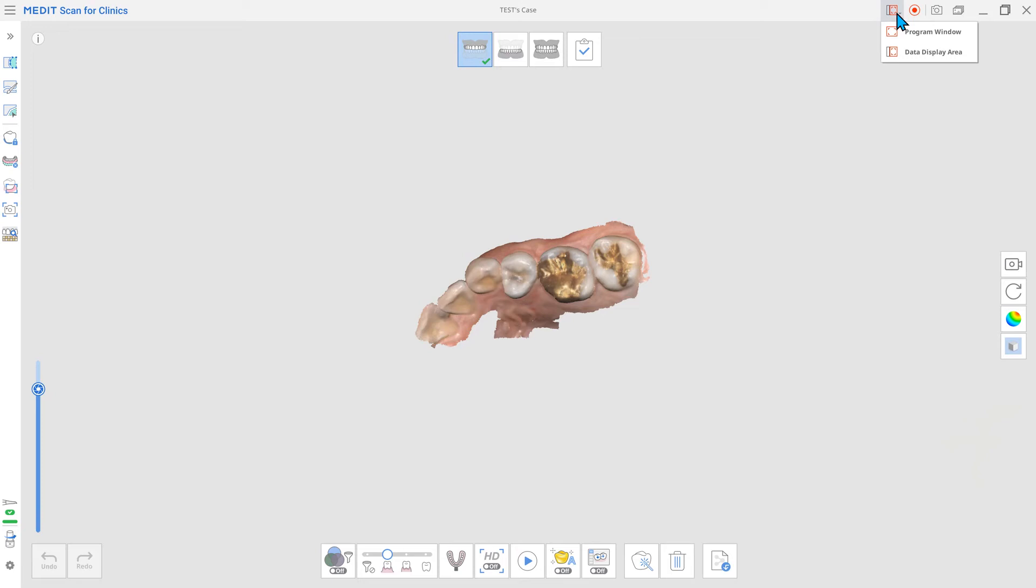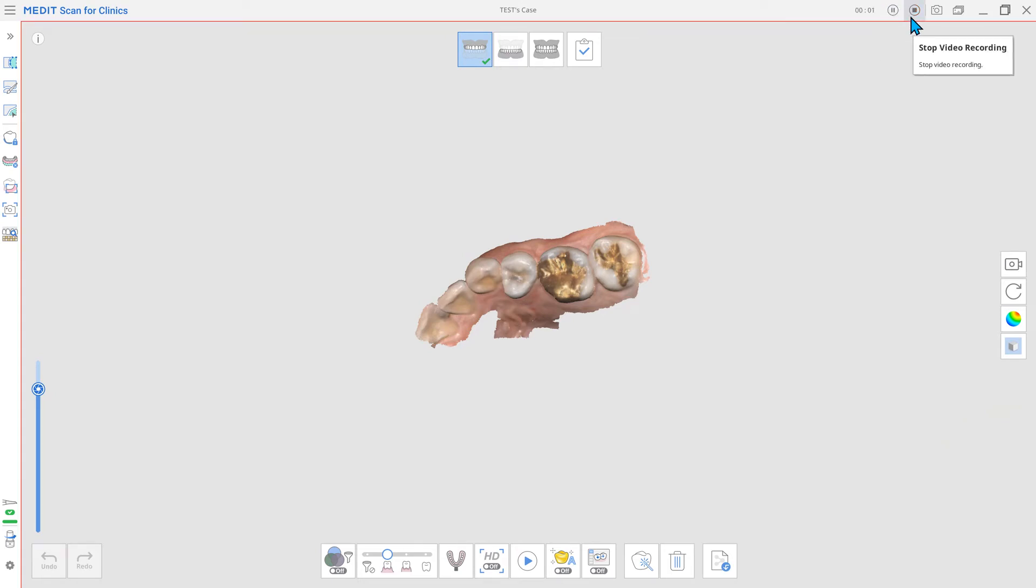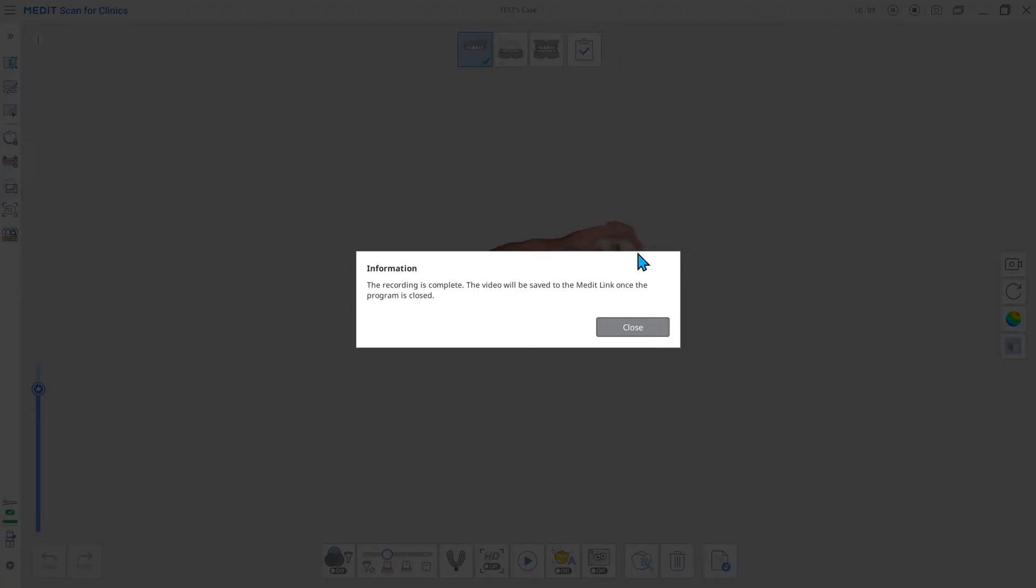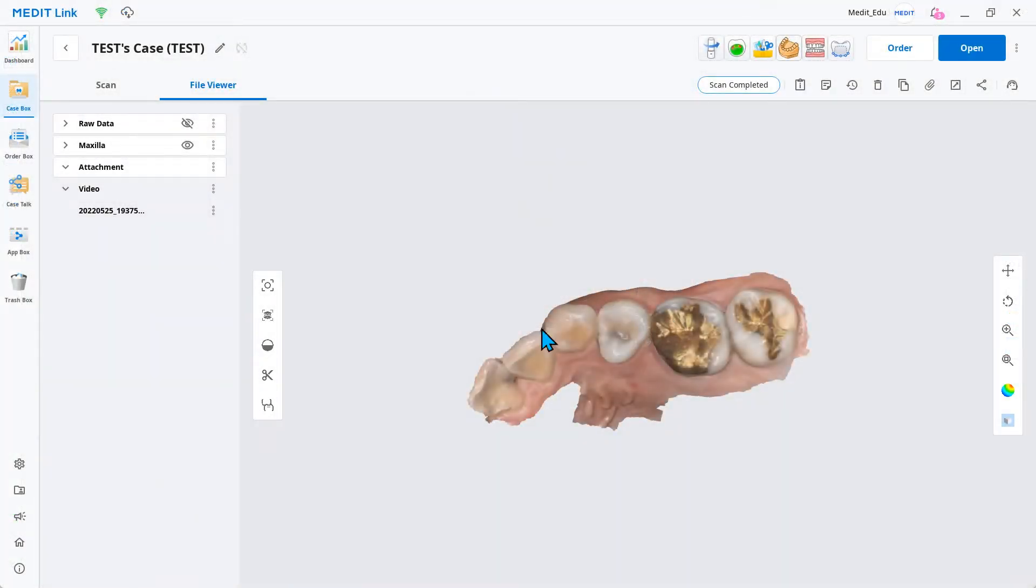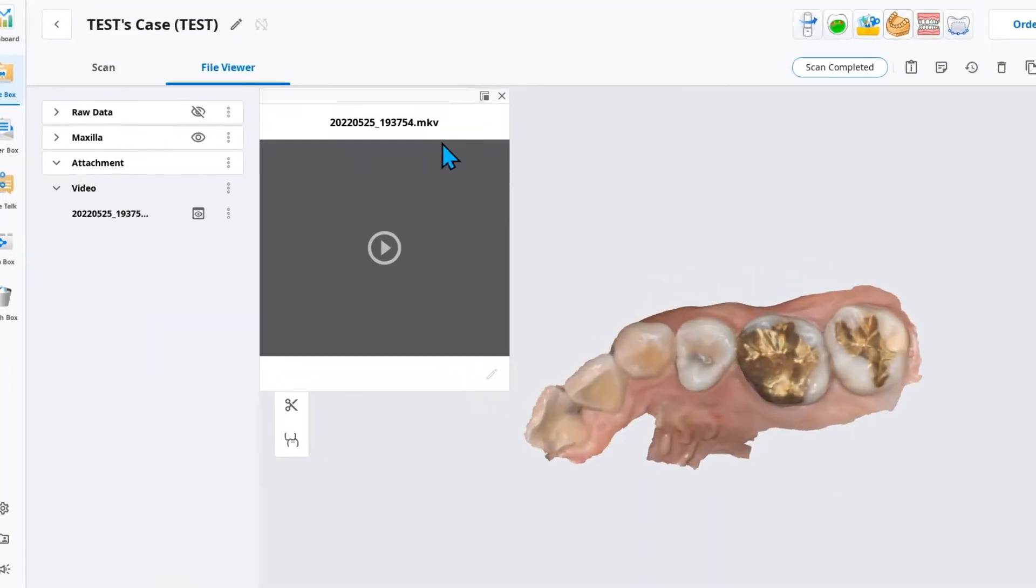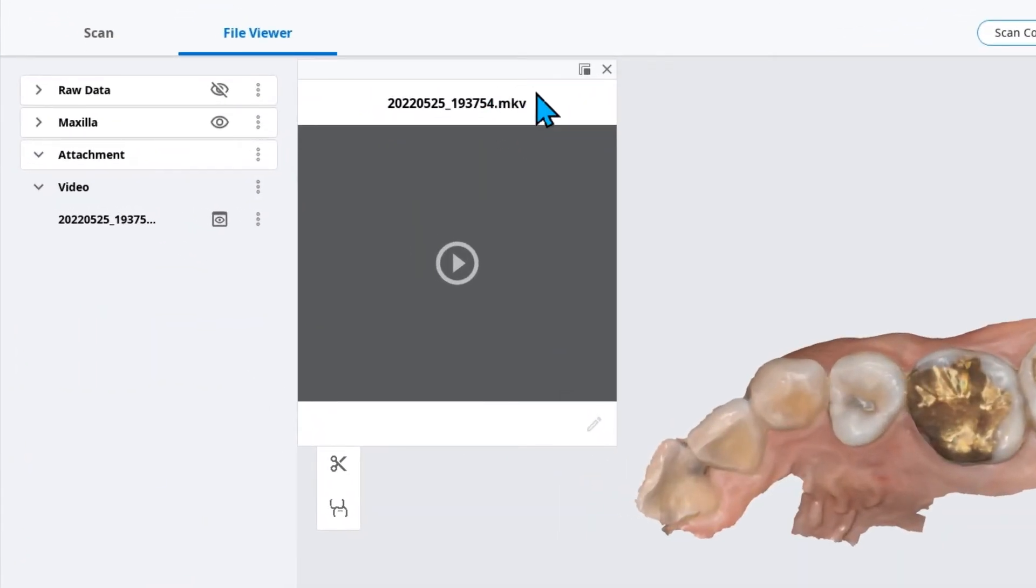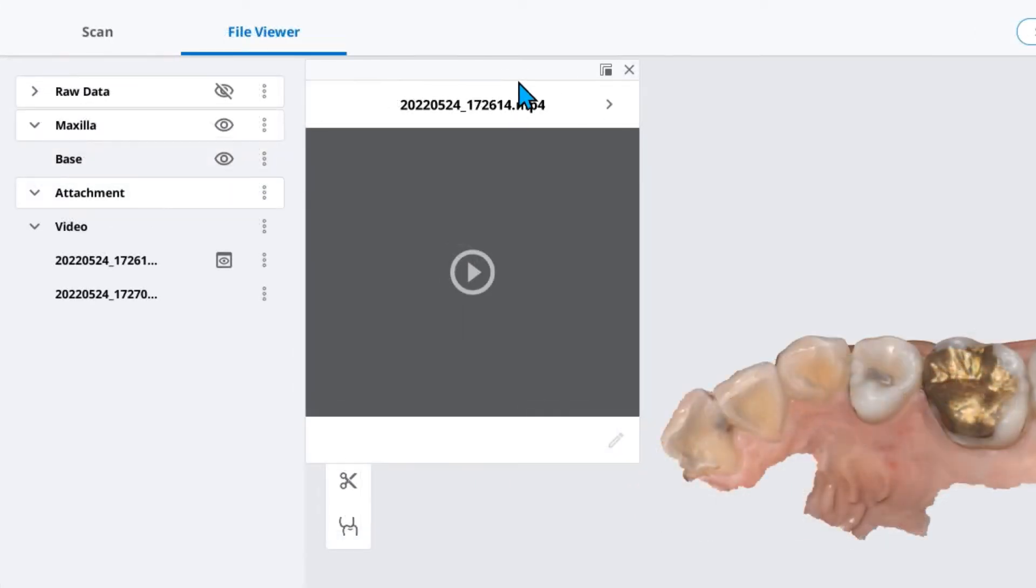Another update to note is the change in the default file format for the recorded videos. In previous versions, recorded videos were saved as an NKV file, but after the update, your videos will be saved in an mp4 format.